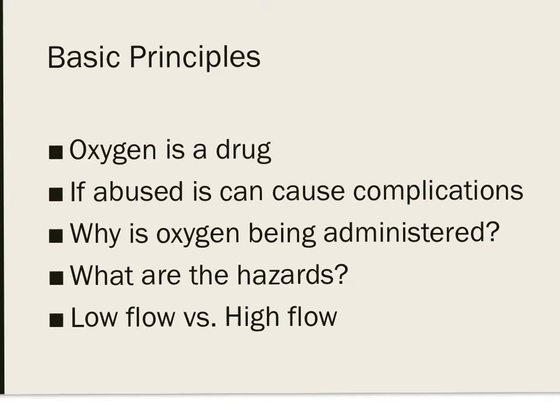So you have to ask yourself, why is the oxygen being administered? Is the need for oxygen therapy over? Is it time to wean? Hazards would be, the main thing I want to point out is that oxygen is combustible. And you need to realize that there are high flow versus low flow devices.